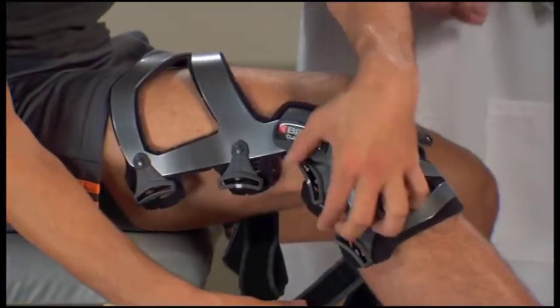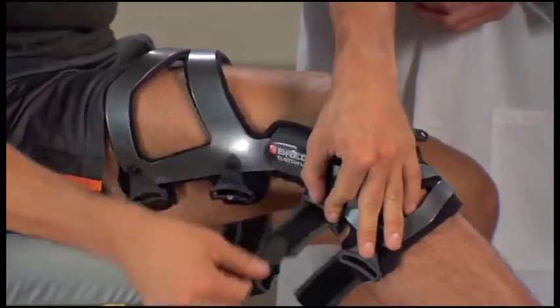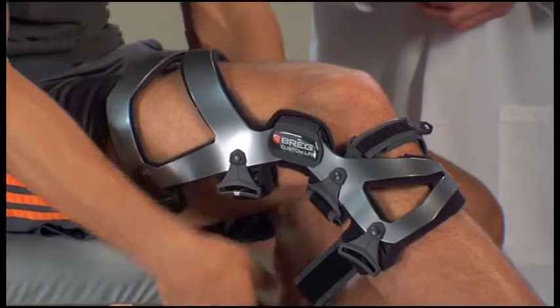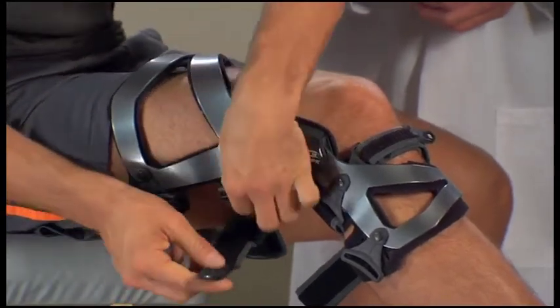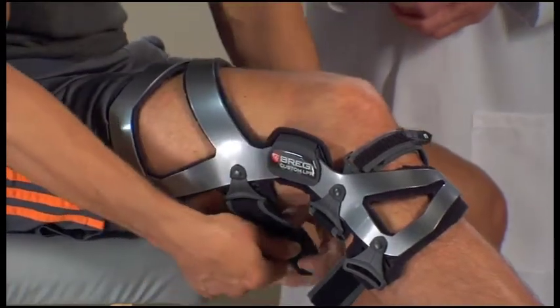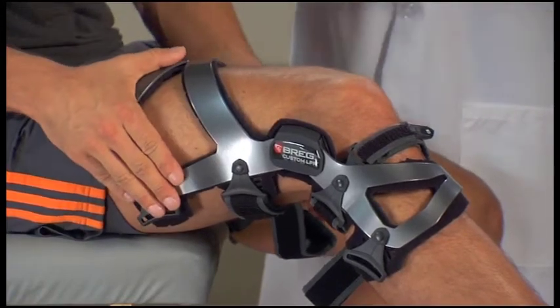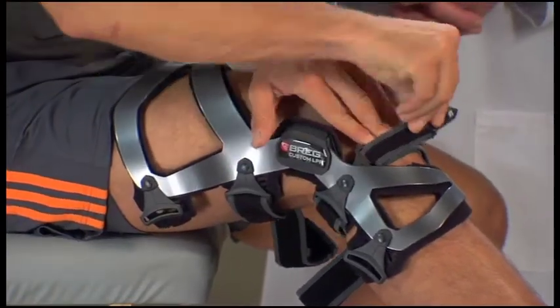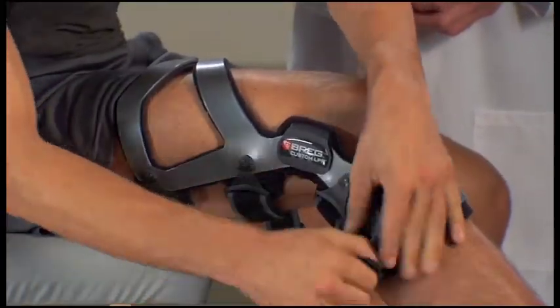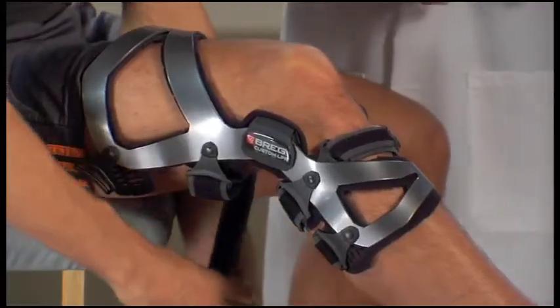If the straps are too long, adjust them accordingly. Fasten strap two in the back above your knee. Make sure the thigh cuff on the front of the brace is pressed flat against your leg and fasten strap three at the front of the brace. Next, fasten strap four in the back at the bottom of the brace. Then fasten strap five in the back at the top of the brace.